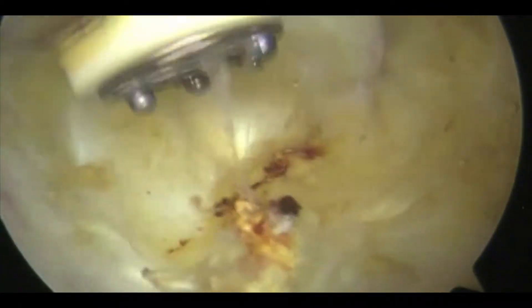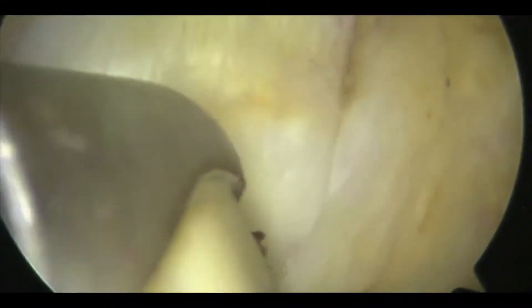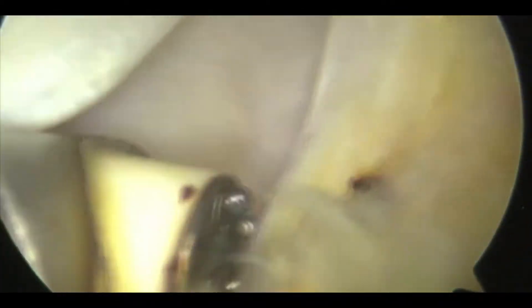We're going to take this dissection a little bit further so that we can fully mobilise the long head. Having exposed the long head, it's actually quite easy to dislocate. Using the end of the radiofrequency probe, we can dislocate it medially. It's pulled medially and then it's going to be held there with a spinal needle.